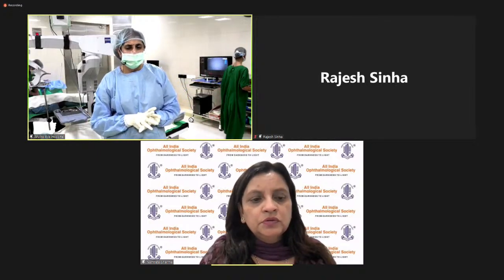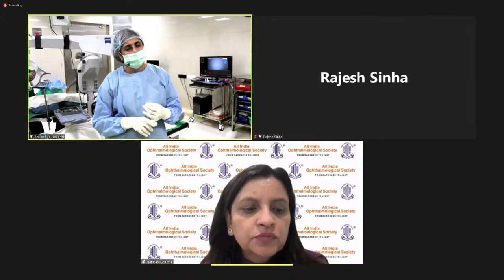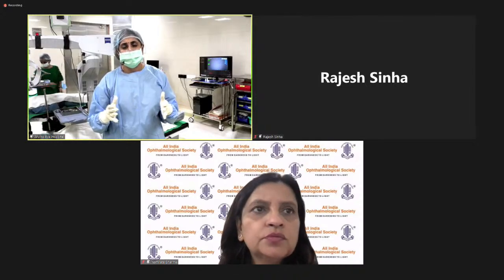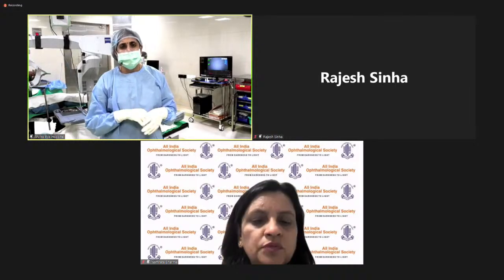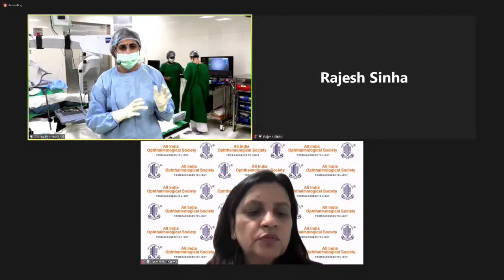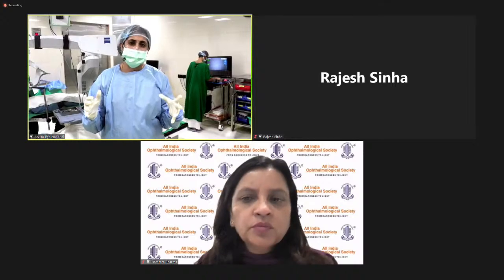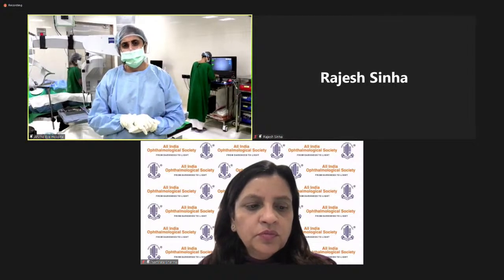Of course, the chance is less, but I think it's more risky in patients with against-the-rule astigmatism and oblique astigmatism, and patients with high cylinder, because there we have to use a toric model like a T8, T9, and even a small rotation can have significant residual astigmatism. So when we do have to reposition a toric lens, it's mostly in these instances, or in high myopes, where the capsular bag is very large and the IOL can be not optimally sized for the capsular bag, and there could be some rotation.